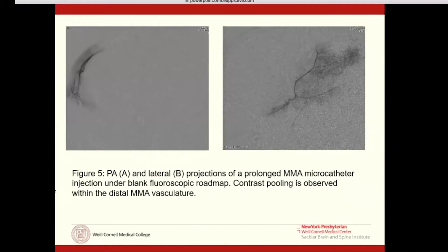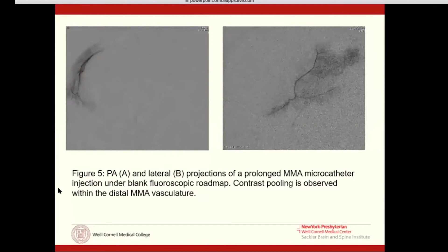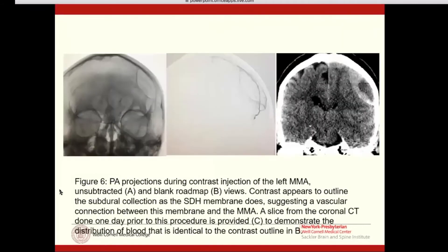Here is an example of what the images look like — on the left AP and on the right lateral — after we've injected PVA particles, which sit in contrast. What you see is the contrast pooling within the subdural hematoma shape itself. This is more radiographic evidence that there's an arterial connection between these arteries and the subdural hematoma, which we've always felt was a venous pathology.